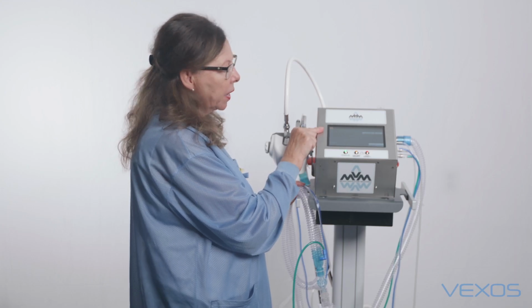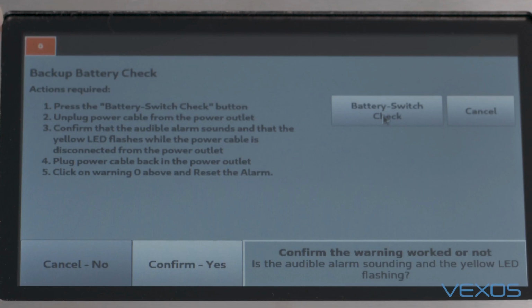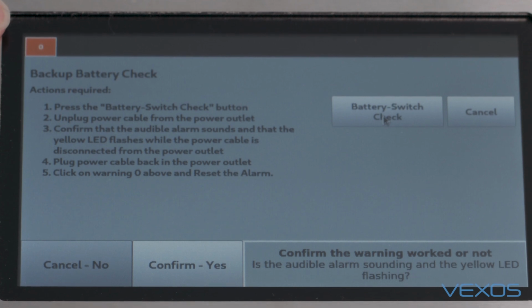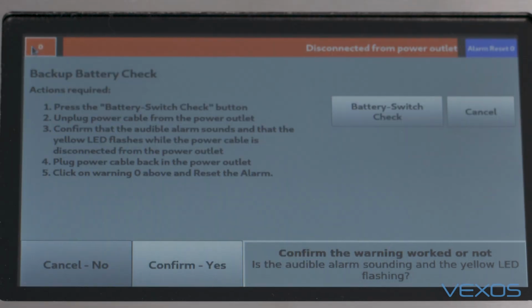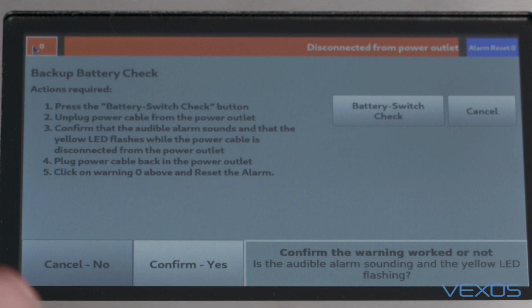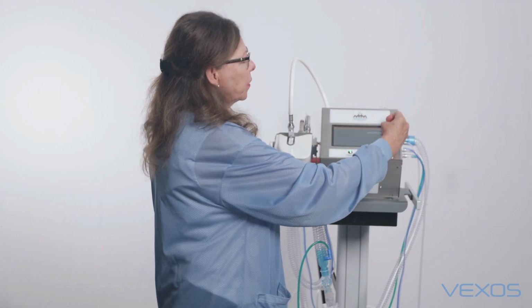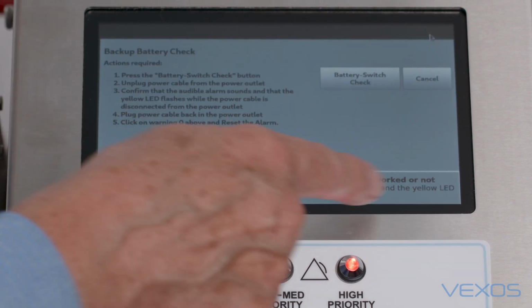When the backup battery check has been completed, you'll note that there's a small square on the left-hand side with a number inside. The number says 0. By pressing that, it expands the message. The message says disconnected from power outlet, so it's another visual that this has occurred, and I need to reset that by pressing the blue button over here. That message now has disappeared.